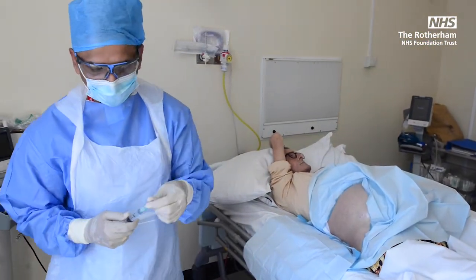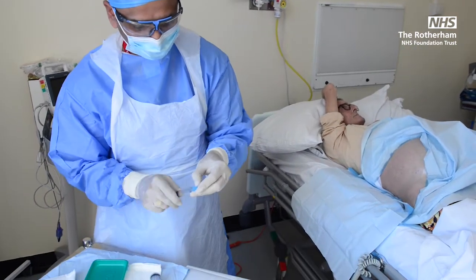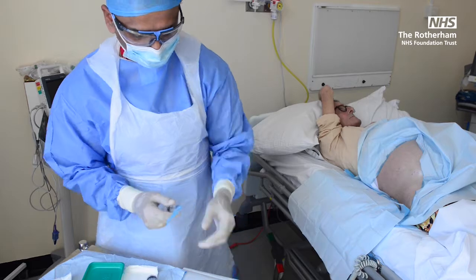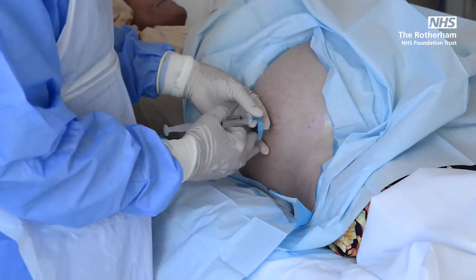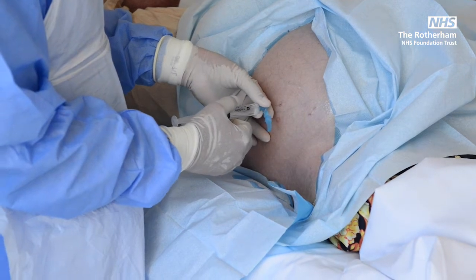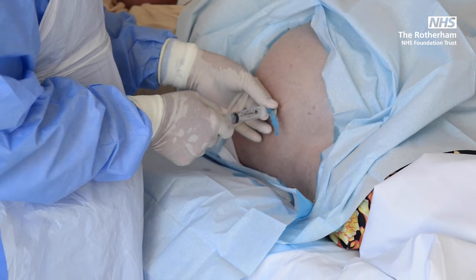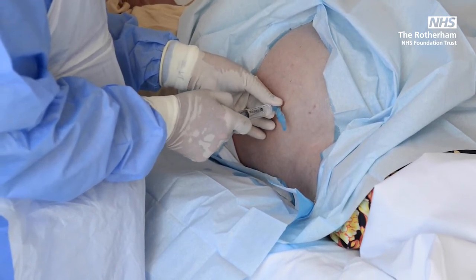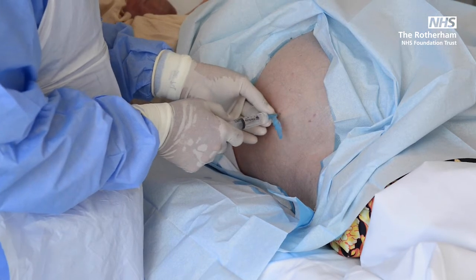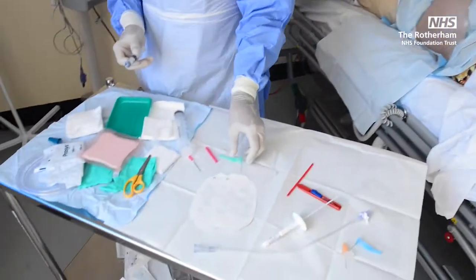Next, I'm going to use the blue needle. Go perpendicular to the skin. Sharp again. Aspirate and inject a bit. Okay, withdraw. And keep the blue needle again onto the side.